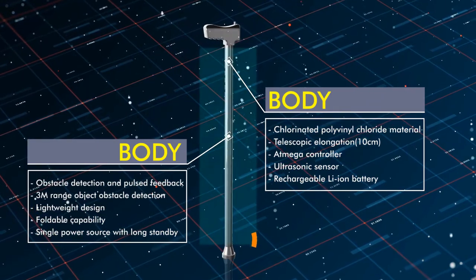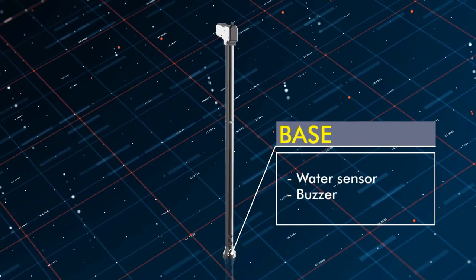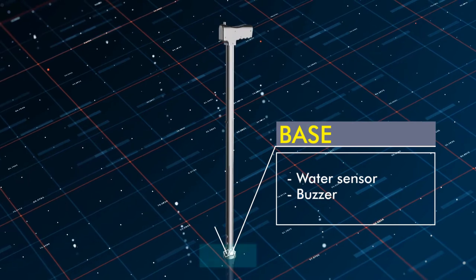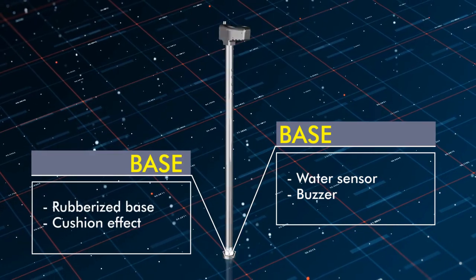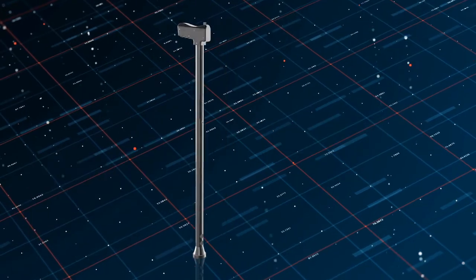Moving forward with the base design — the base consists of a water sensor, controlled by the Arduino placed in the body, which is also used for the ultrasonic sensor. The base is made up of rubber material, providing a cushion effect and more comfort to the user.